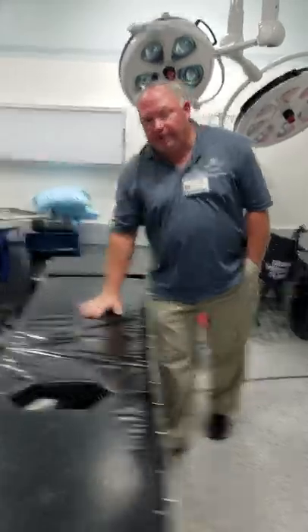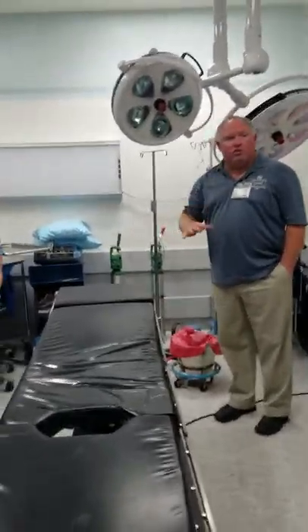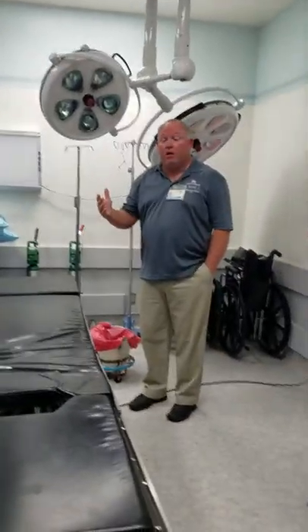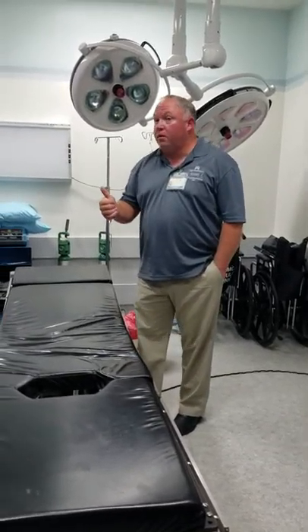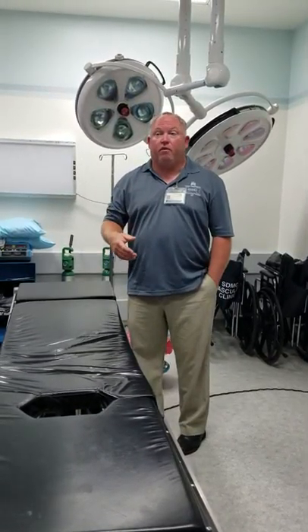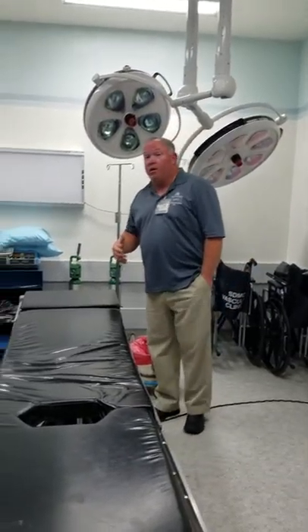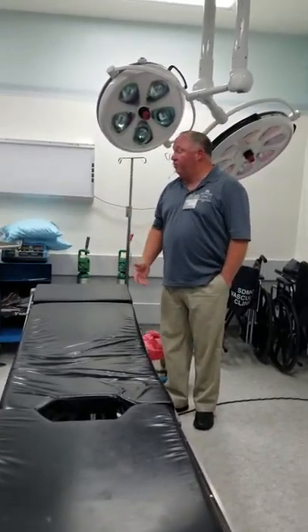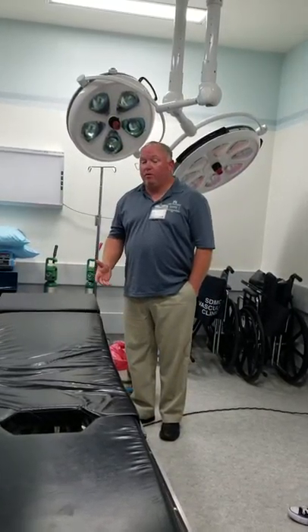The patient's supine. Once the patient is supine, they get a Foley in. Once the Foley is in, we kind of take over — we're there with the doctor and we're going to position the patient. Now we talk about supine versus lateral. We're going to do an anterior approach, so it's going to be supine for the most part.